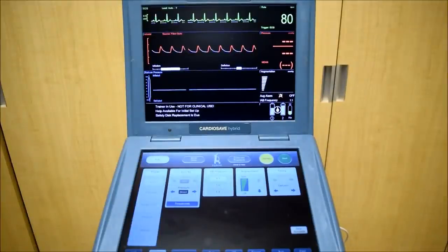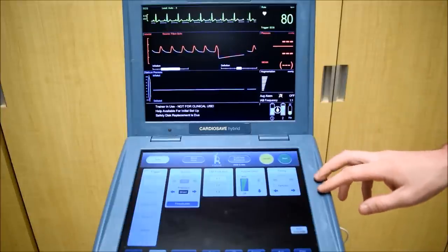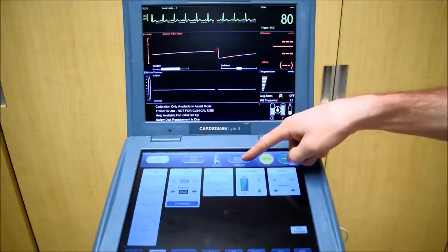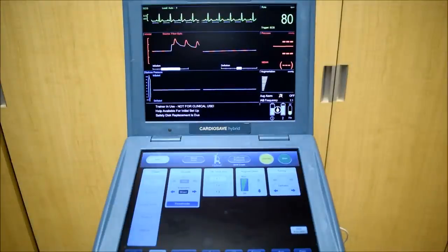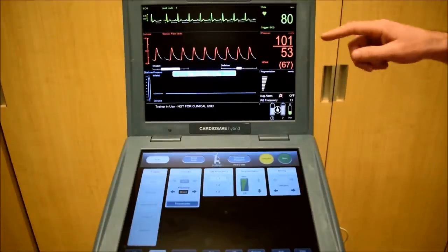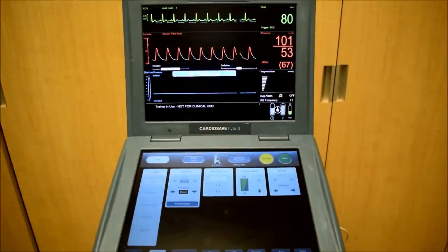I'm going to quickly calibrate our pressure transducer. We want to open that to atmospheric pressure here and press and hold this calibration button. Now that the pressure transducer is zeroed, we can see our systolic, diastolic, and mean pressures here.